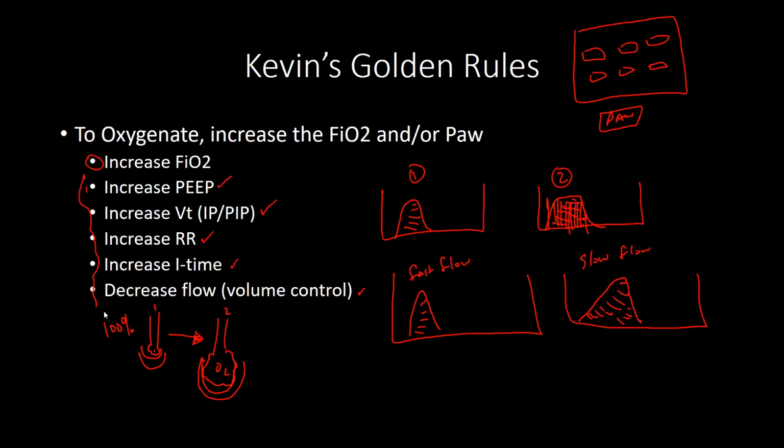And I must say too, with the ventilators, I'm more comfortable with the volume control modes than the pressures. I kind of got the concept of pressures, but when I'm actually trying to do it, or like you say, working with a practice ventilator and a lung, it takes me a little bit to get used to the pressure control mode.